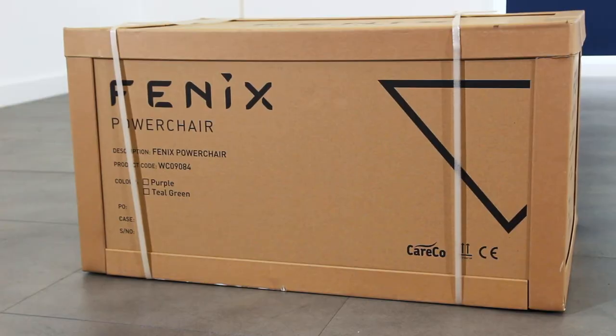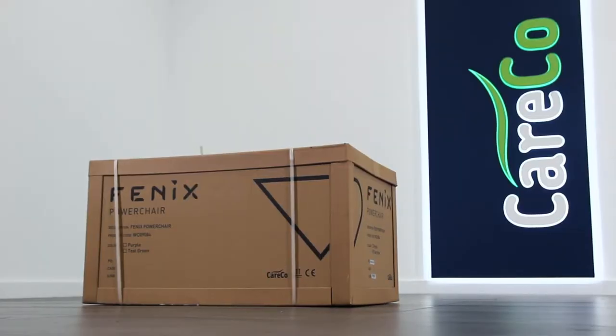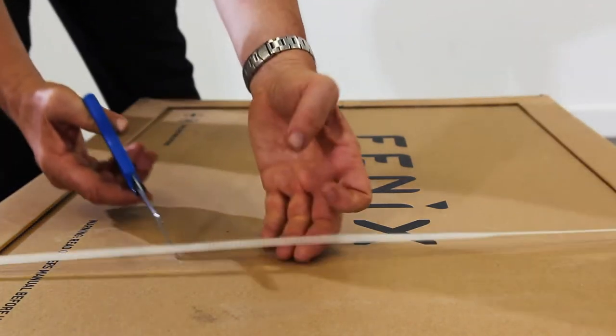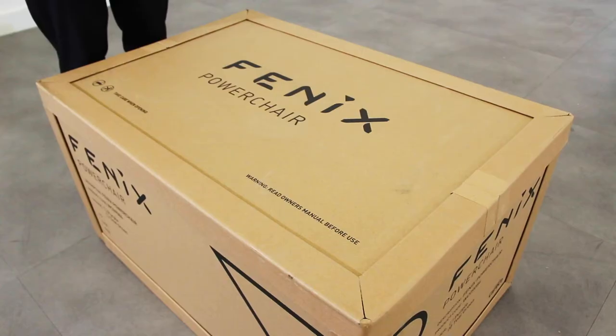Your Fenix Powerchair should come fully boxed as seen here. Courier delivery straight to your doorstep is available from Careco. With a knife or a pair of scissors, carefully cut any tape or straps surrounding the box.